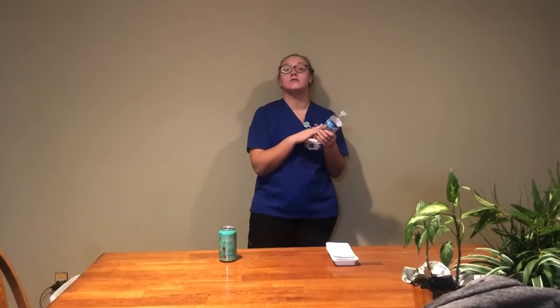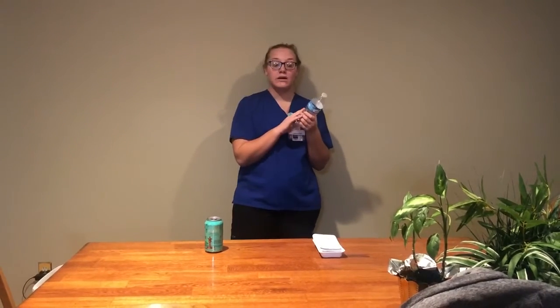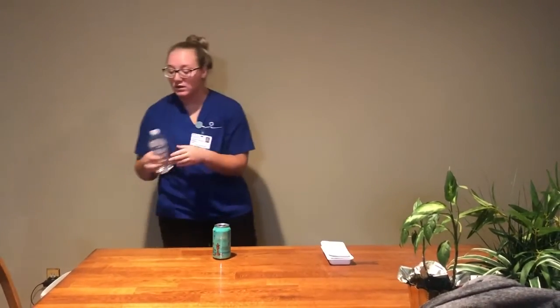Then I will check it again. Dose is however much is needed, time is now, route is trach, the reason is to moisten my catheter, individual is Miss Smith, and the medication is normal sterile saline. And then once more, to confirm. So I'm going to set that back over here.